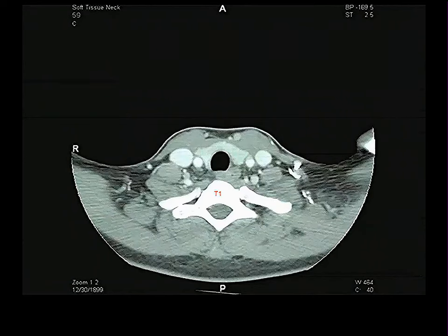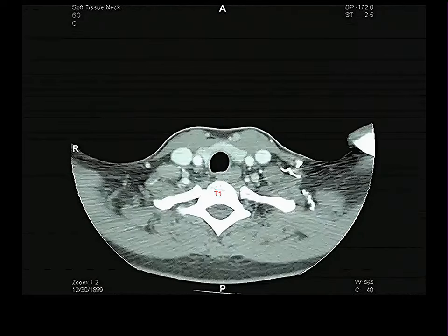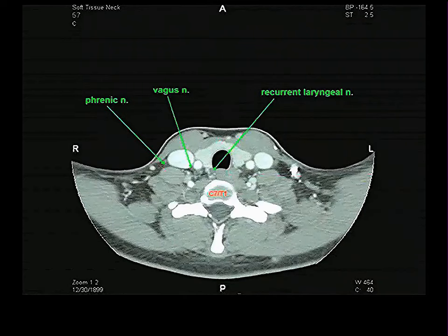Nothing exciting. Still trachea with that flattened or even concave posterior wall. This is just labeling these things. This muscle, which has not previously been labeled, but it's always been there, posterior to the internal jugular vein, is the scalenus anterior muscle. And here is the esophagus. This whole thing here, even though there's no air in it, is the esophagus, both behind and to the left of this person's trachea. Now, do you have good imaginations?